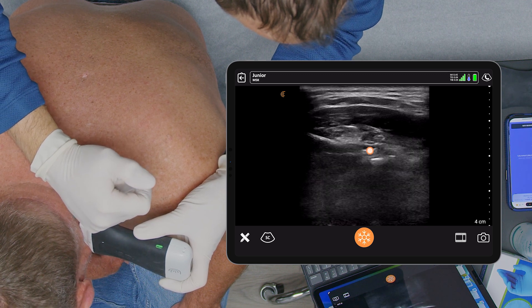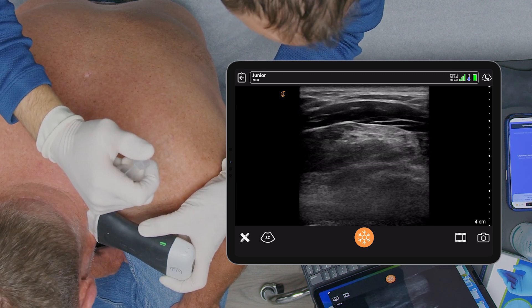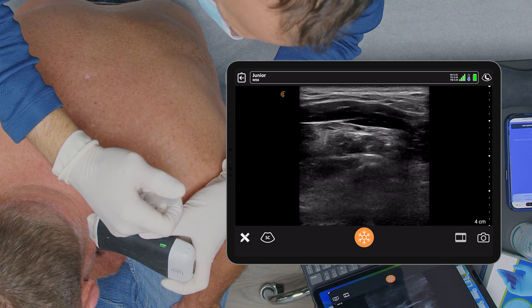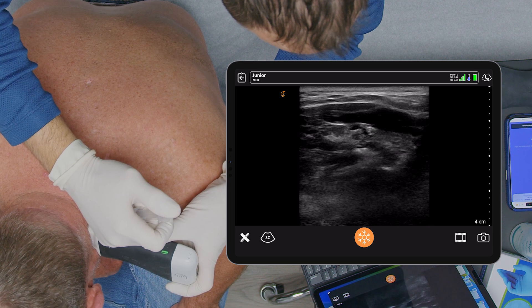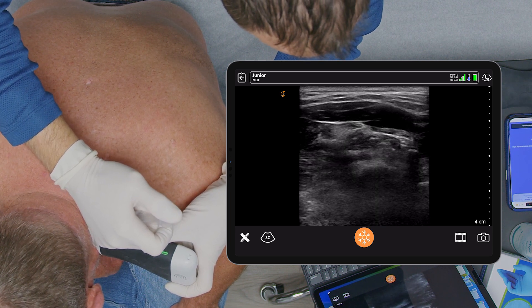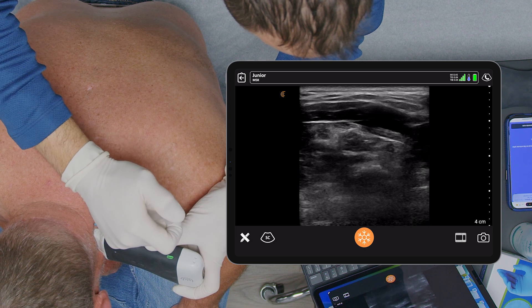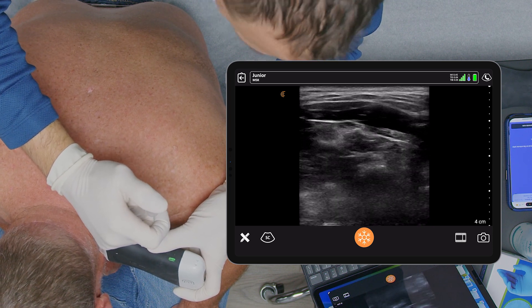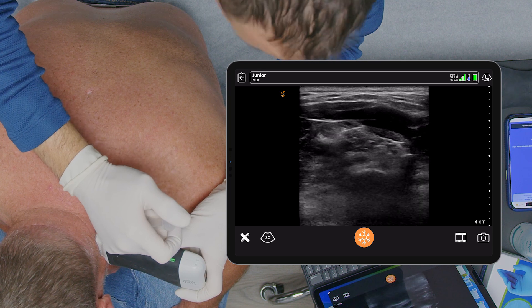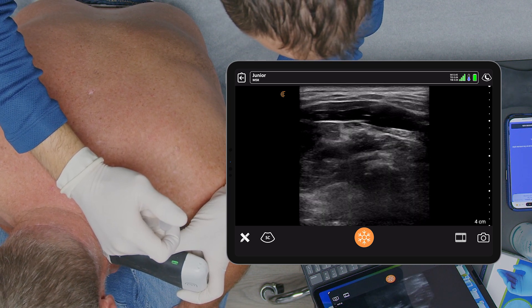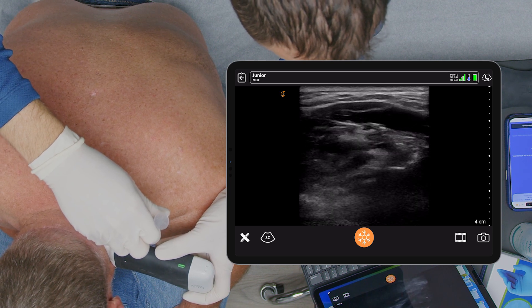I'm going to go one level down and pinch again. I'm also depositing some of the local anesthetic at the trigger points in his neck, superficially.